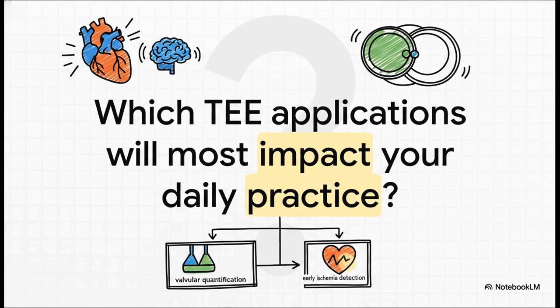And with that, we've reached the end of our explainer. I'll leave you with one final question to think about. As this amazing technology continues to get better and better, with things like AI analysis right around the corner, which of these applications do you think will have the biggest impact on your day-to-day practice and, most importantly, on the well-being of your patients?